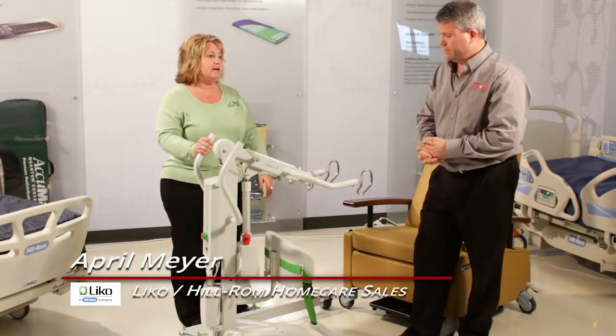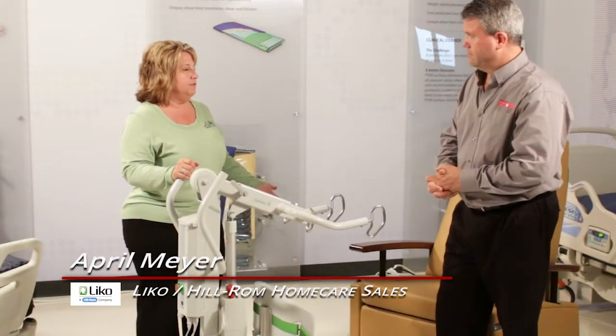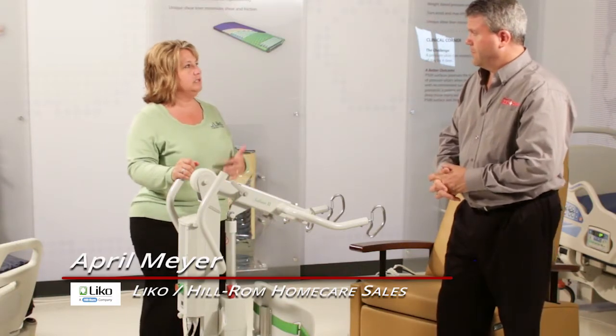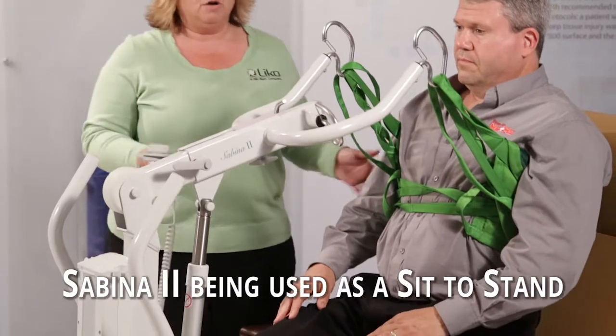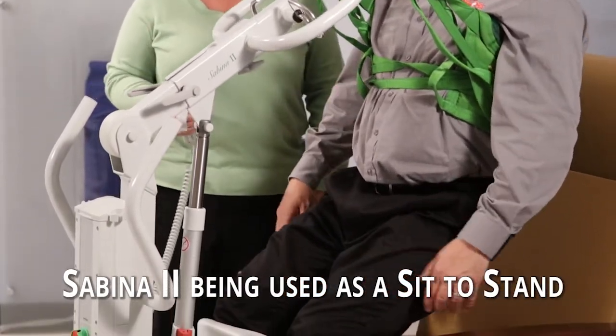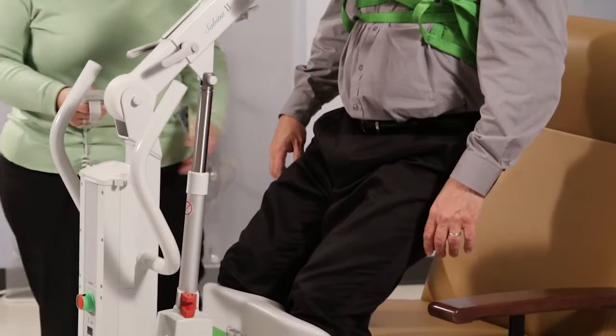What's also great is that this works as a lift for a patient that has a degenerative disease, like ALS or MS. We know that at some point, unfortunately, they're going to progress. They've already invested the money, and they can still stand — so let's keep them standing and using the rehab in their legs when we can.